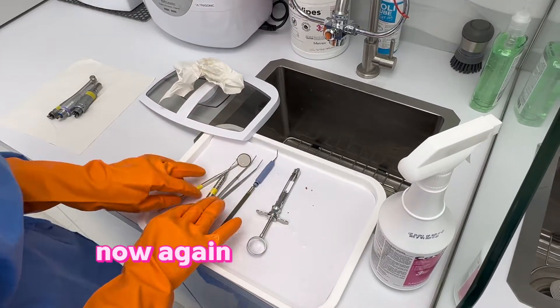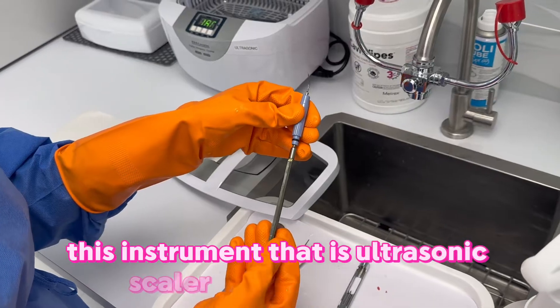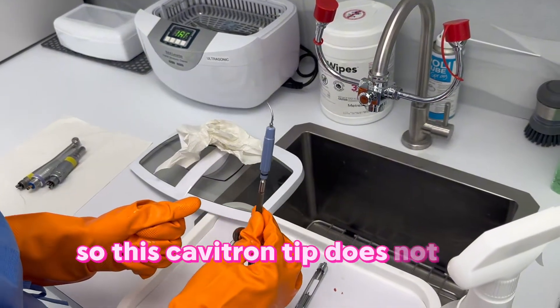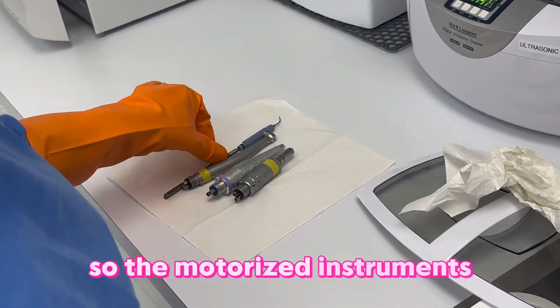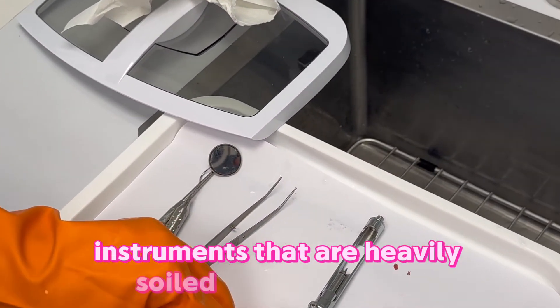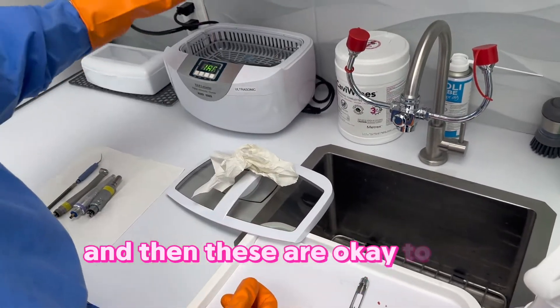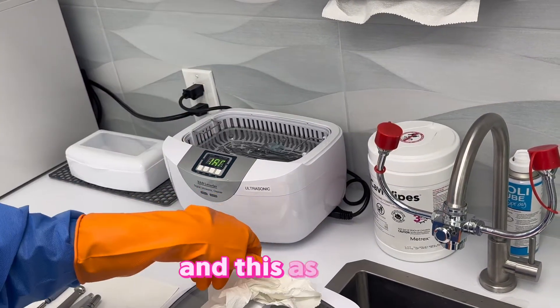Now again we're sorting the instruments. The ultrasonic scaler — the cavitron tip — does not go in the ultrasonic cleaner. Motorized instruments and the cavitron tip do not go in there. Instruments that are heavily soiled with blood we're also going to clean first, and then these are okay to be placed in the ultrasonic cleaner.